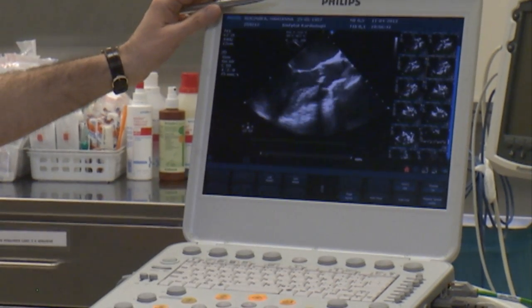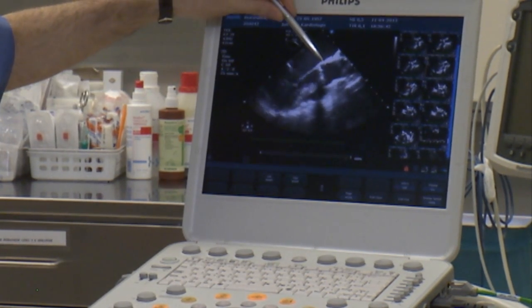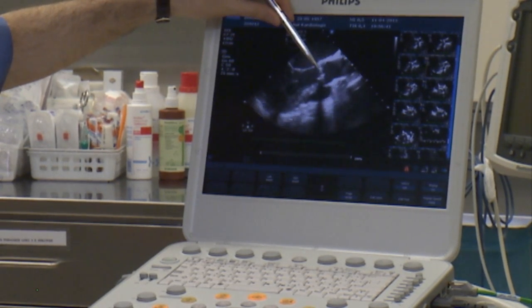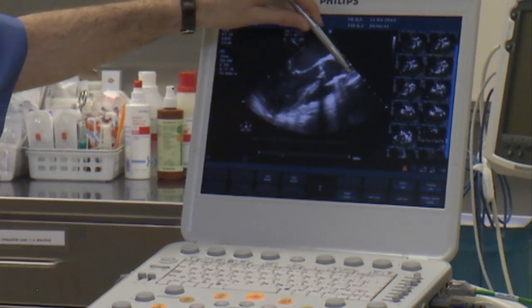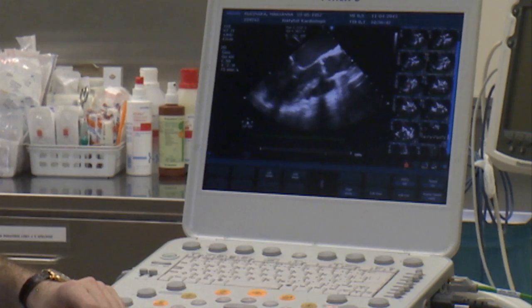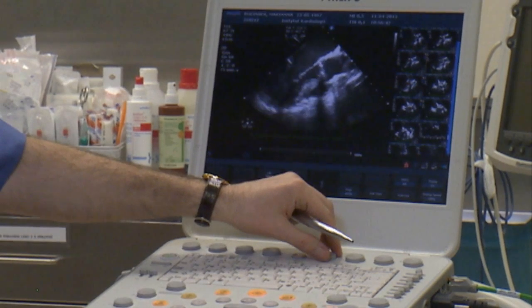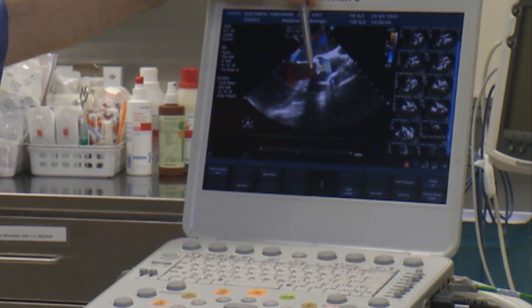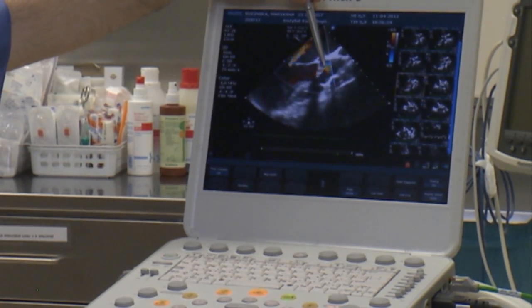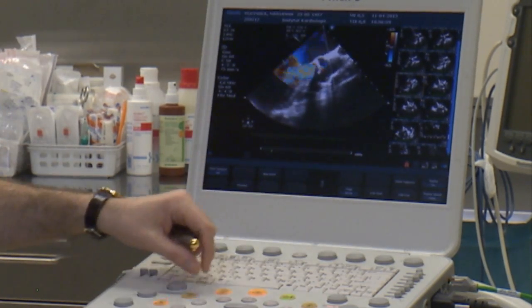Fine. What you see in the first image is the transesophageal echo of the aortic valve, which is heavily immobile with just a minute opening of the leaflets, and also a heavily thickened aortic wall, which is one of the main reasons for performing TAVI in this patient. Next is the color Doppler, just a short glimpse of a huge aortic regurgitation, which adds to the problem. So we have a complex lesion, both aortic stenosis and aortic regurgitation.